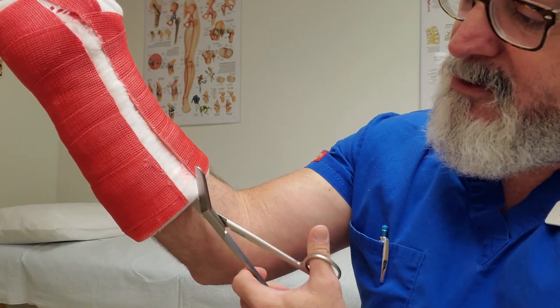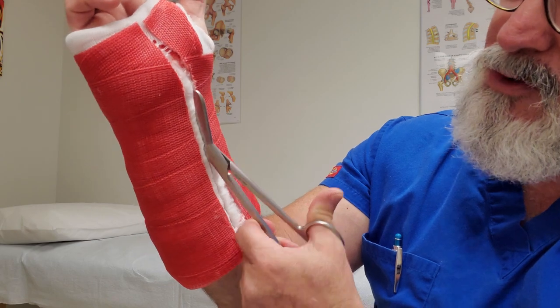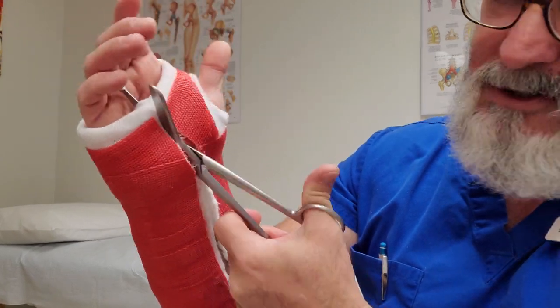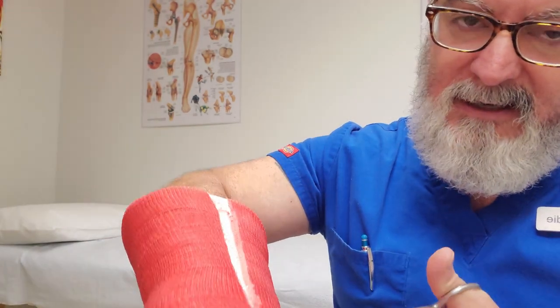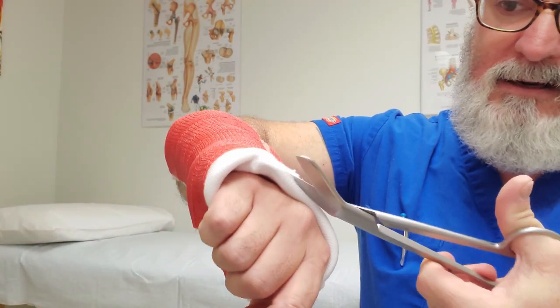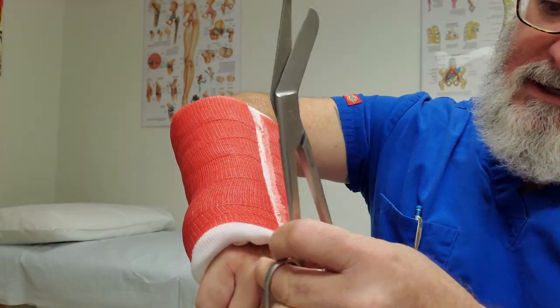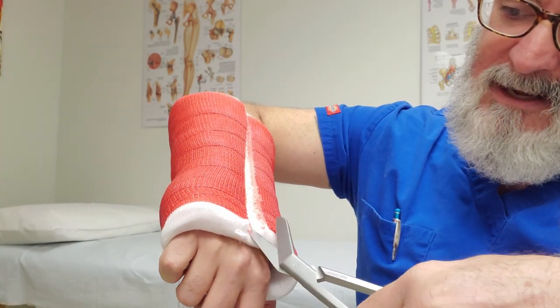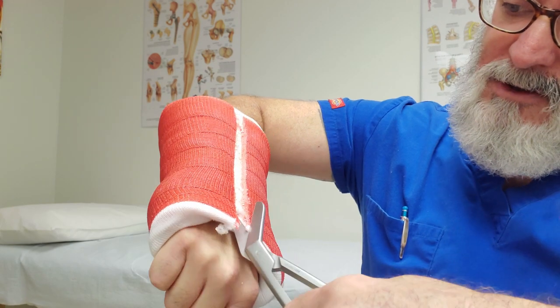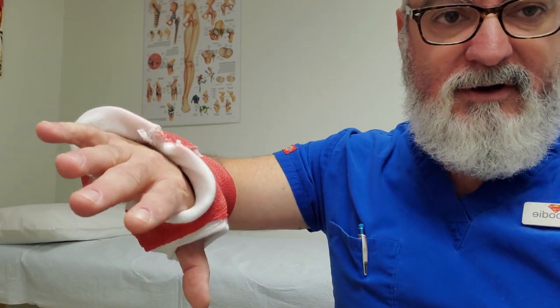Then you get regular safety scissors and just cut through the cotton. Now, if you have somebody who's a little nervous with the scissors, here's a trick: you can cut the lip of the stockinette and run the scissors between the stockinette and the cotton, so the scissors travel the length of the arm between those two layers. That keeps the scissors from rubbing on the skin and helps with the fear factor on kids as well.